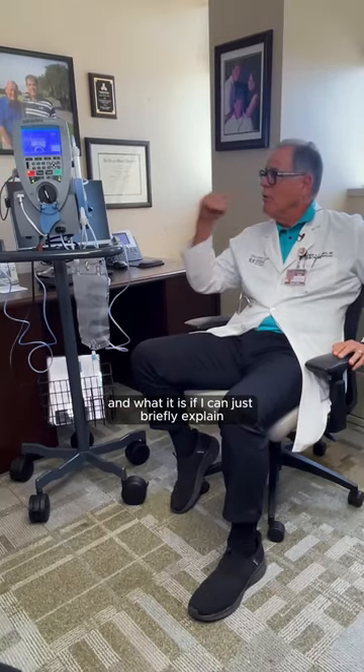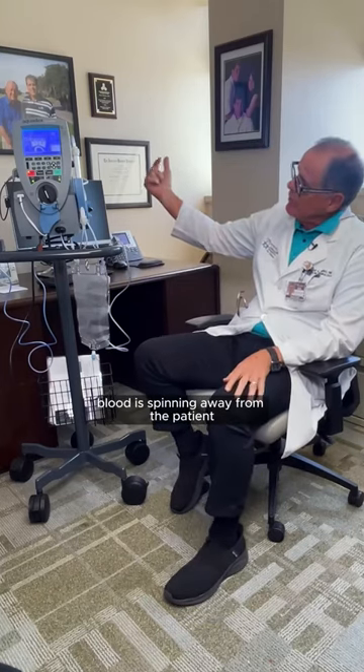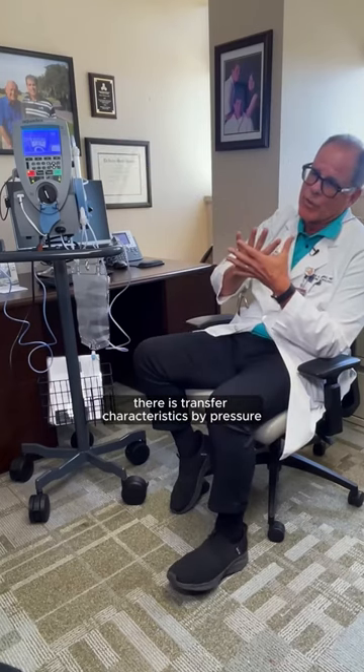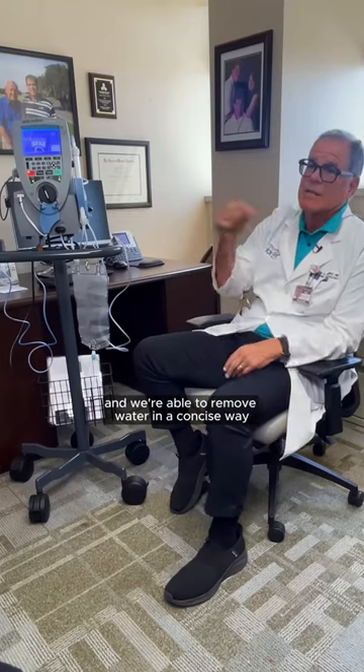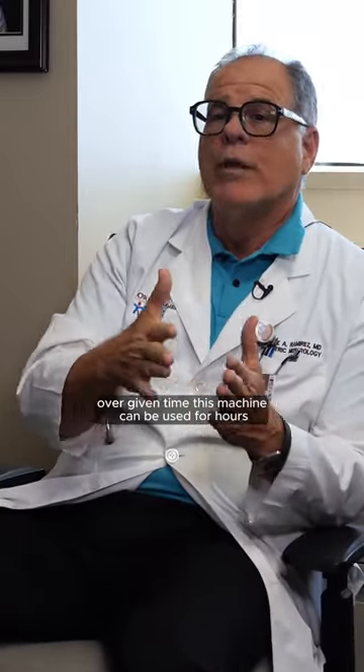If I can briefly explain: blood is drawn away from the patient and goes through this filter. Along this filter, there are transfer characteristics by pressure that separate blood from water, and we're able to remove water in a precise way — really prescribing how much fluid patients can tolerate to have removed over a given time.